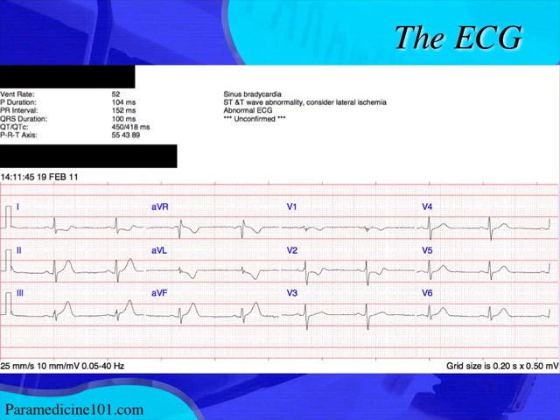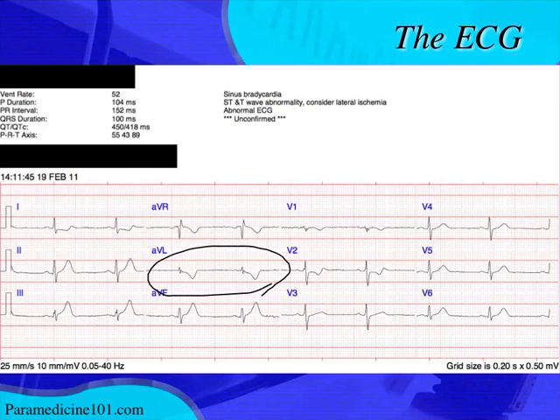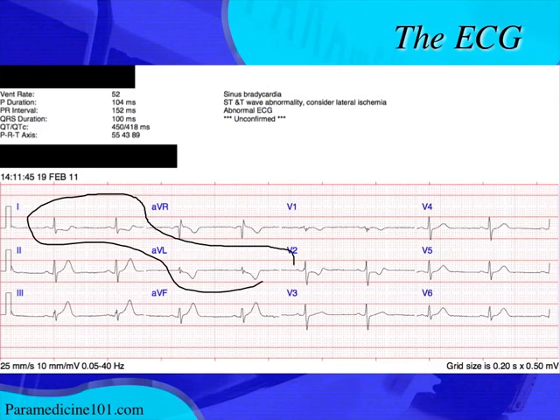A hyperacute T wave has a broad, wide base and is tall and symmetrical. This is indicative of a hyperacute T wave, and you see them in leads II and AVF as well — AVF has about half a millimeter of ST elevation. This ST depression with T-wave inversion in AVL, this down-scooping pattern, is one of the earliest signs of inferior wall MI. You also have ST depression in lead I, which is contiguous with AVL — these are reciprocal changes of an inferior wall MI.